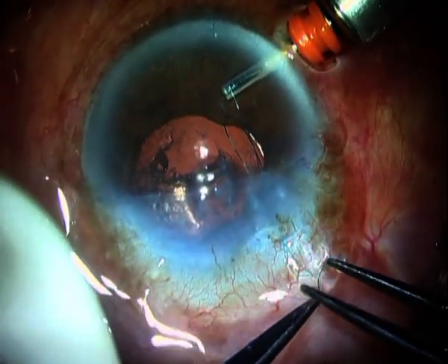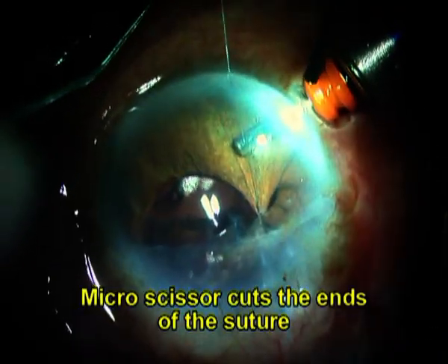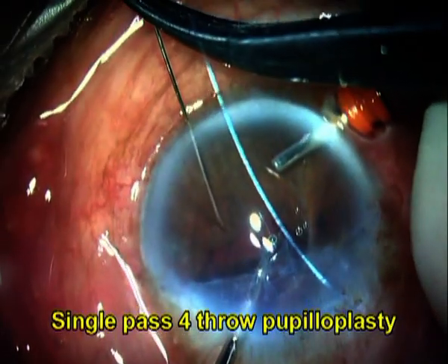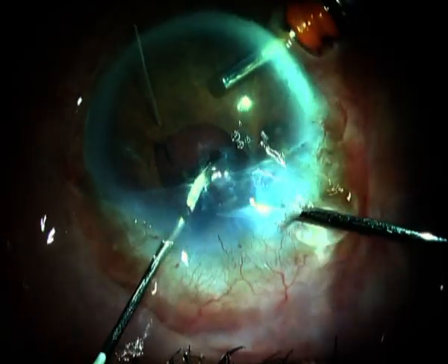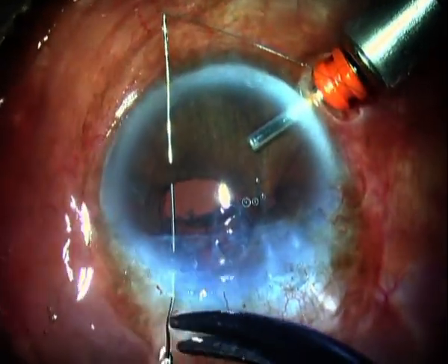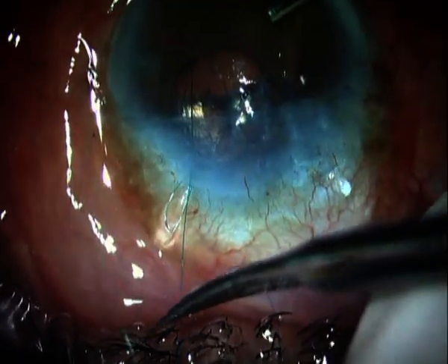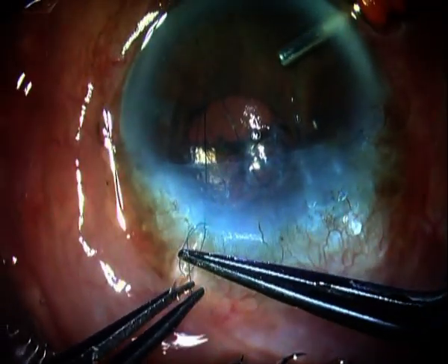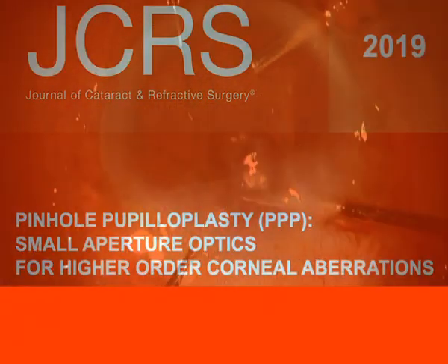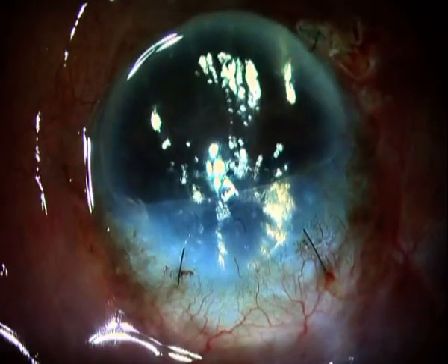The AC can be maintained with either an ophthalmic viscosurgical device, OVD, or with fluid infusion with the help of an anterior chamber maintainer or a trocar ACM. Usage of an endo-illuminator can help in visualization, though it is not mandatory. Pupilloplasty can be performed with any technique: cerclage, Siepser's, mechanical, or 4-throw pupilloplasty. The idea is to create a pinhole pupil of approximately 1.25 to 1.5 mm. The advantage in single-pass 4-throw pupilloplasty is one can do it as many times as needed till an ideal size pinhole is created.